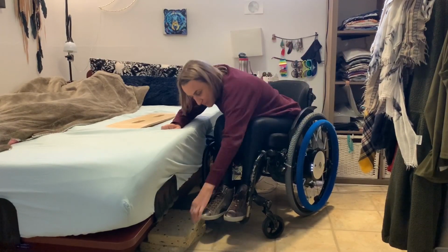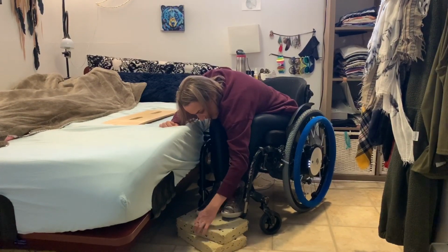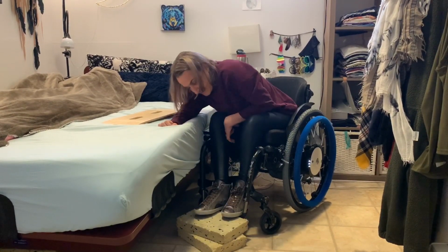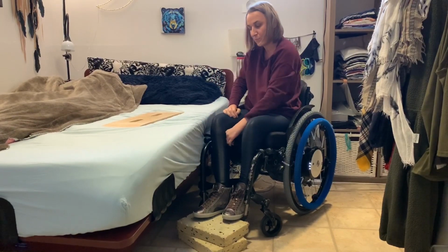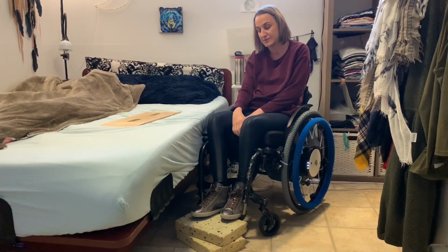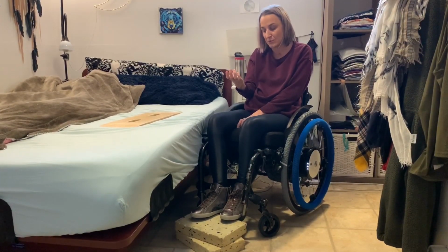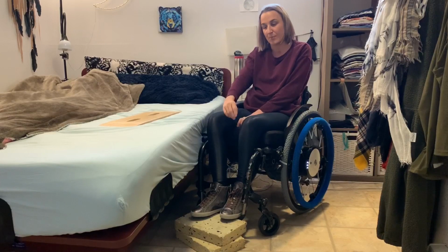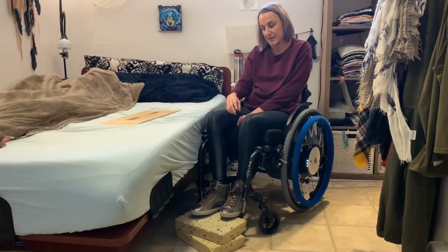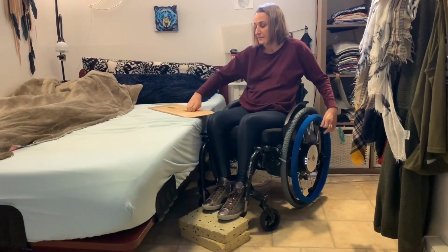I normally also have some blocks that I put down in front of my chair. These were just yoga blocks that I had prior to my injury, and I keep them underneath my bed to use. What they basically do is level up the ground to prevent your legs from dropping down, so it makes it easier to transfer.